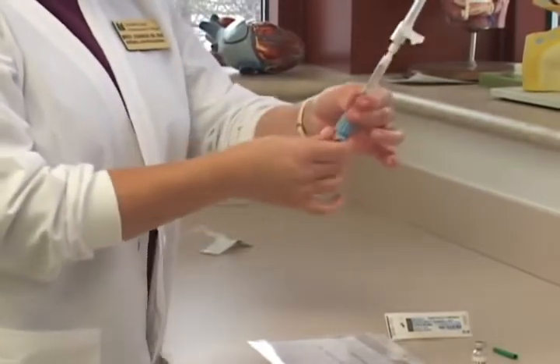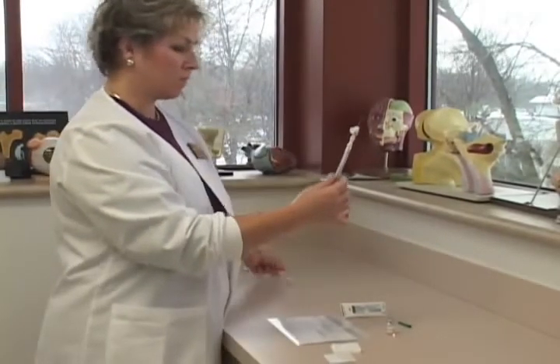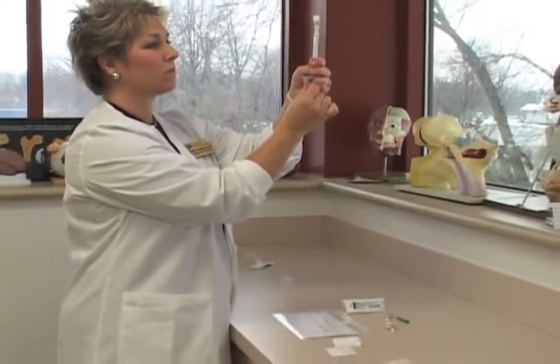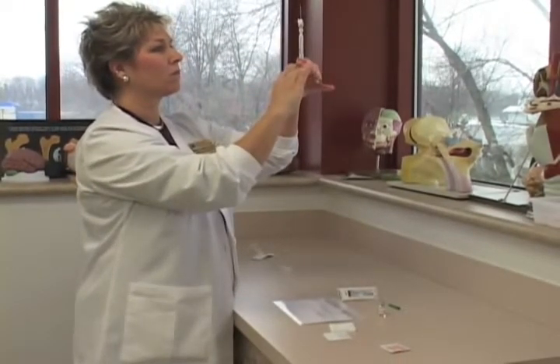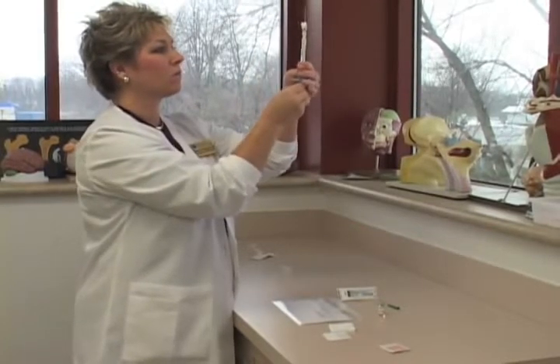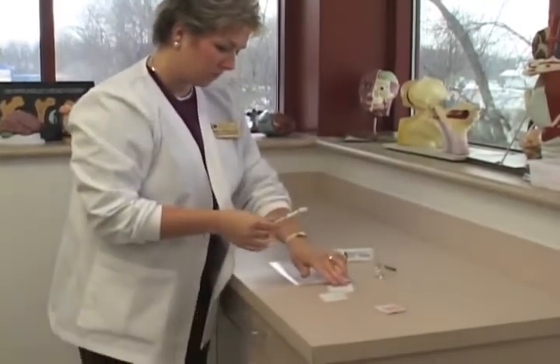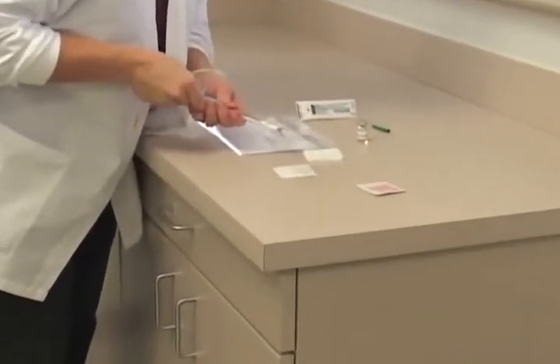And correctly expel the excess air while holding the syringe in an upright position. And then by wasting the excess solution while holding the syringe in a dependent position, pointed downward.